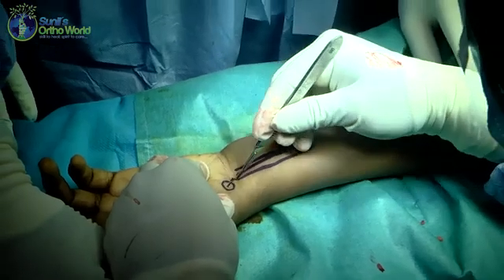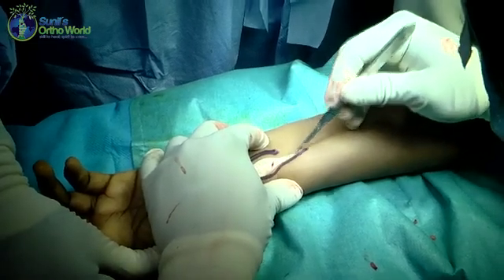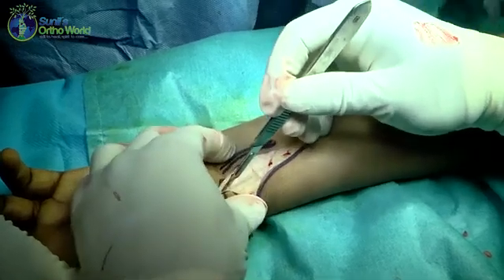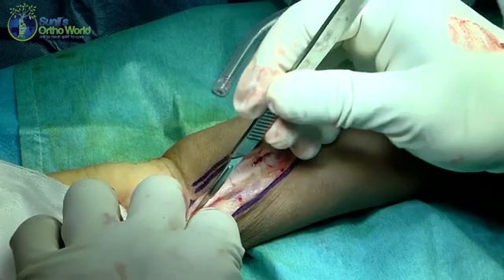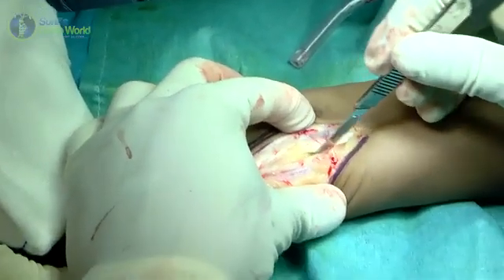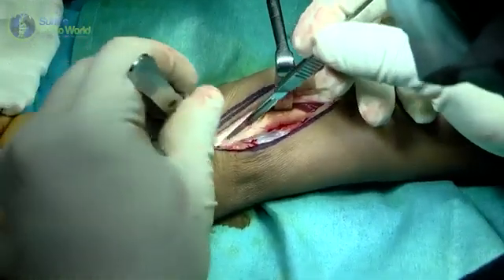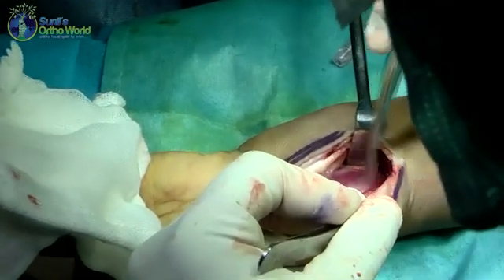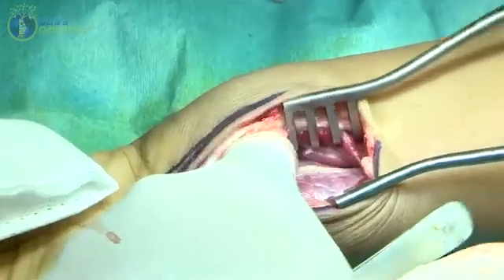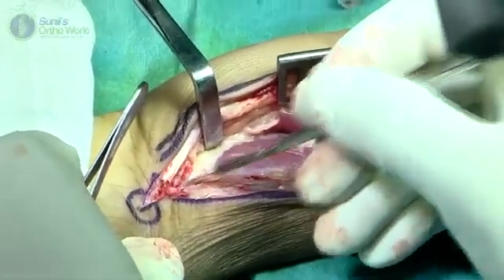The arm is positioned on an arm table with the tourniquet inflated and a formal timeout is performed. A curved incision crossing the palmar wrist crease is made over the FCR tendon and is deepened down to subcutaneous tissues and the fascia. The FCR tendon sheath is then incised and the plane between the FCR tendon and the neurovascular bundle on the radial side is entered. This plane is further developed to enter the space of Parona.